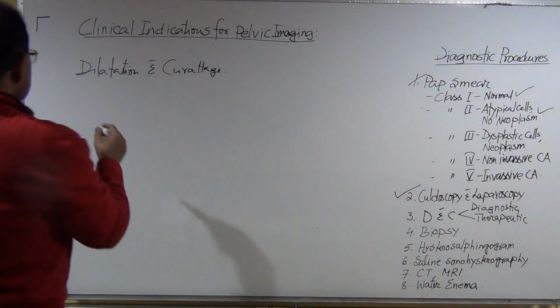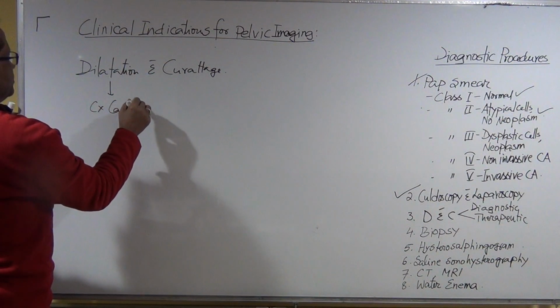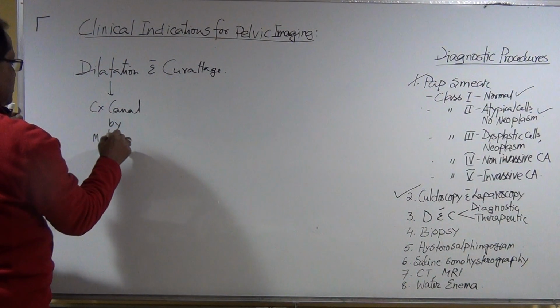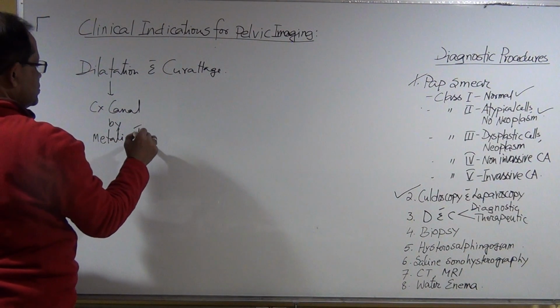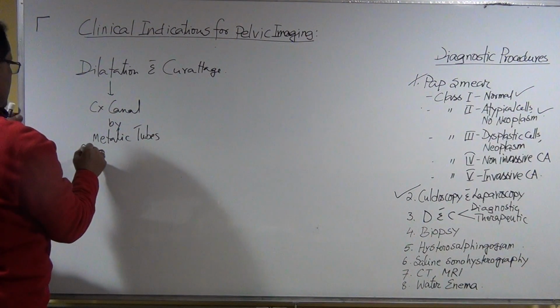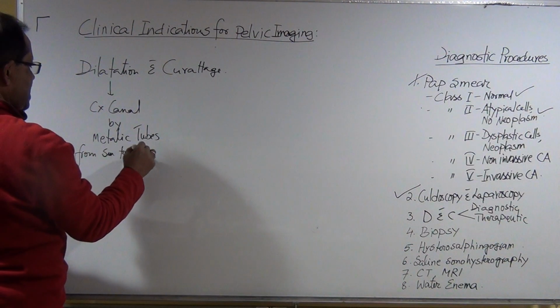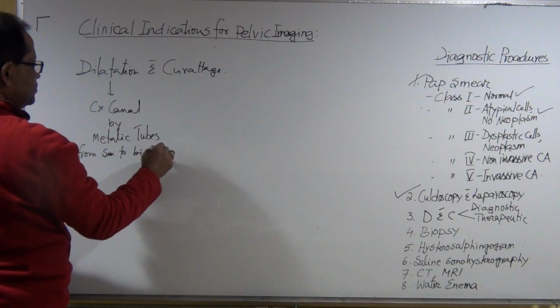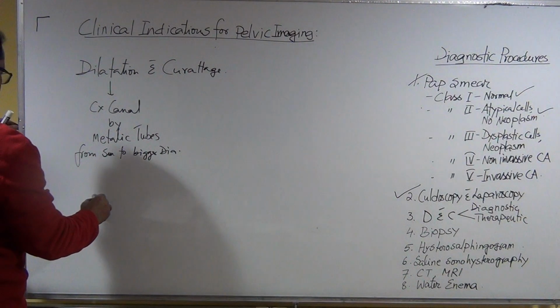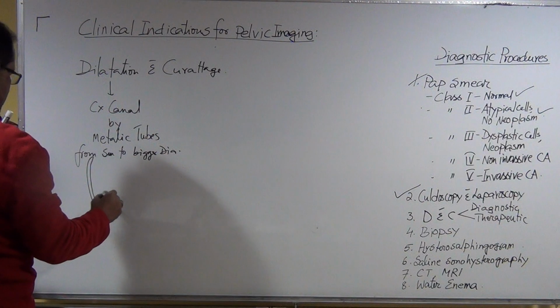During the dilatations of the cervical canal by metallic tubes from small to bigger diameter. Okay, and that tubes are not tubes, actually metallic bar, metallic rod.